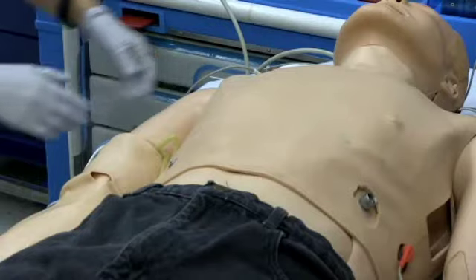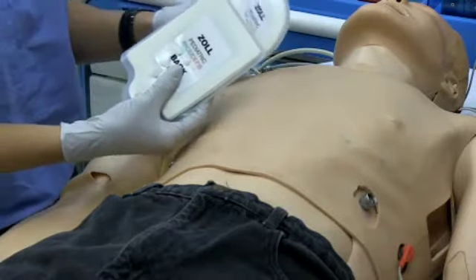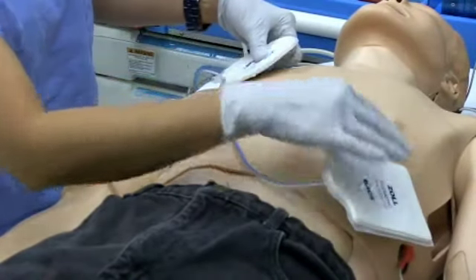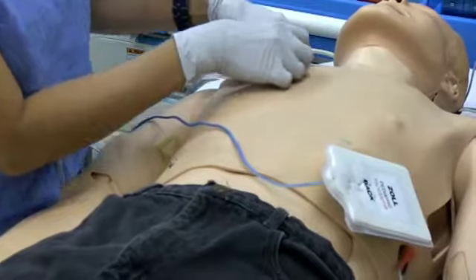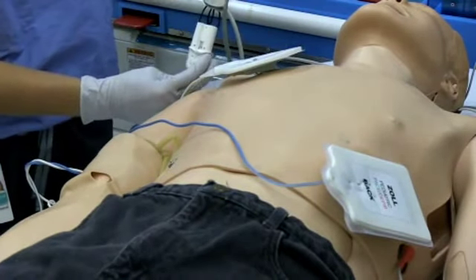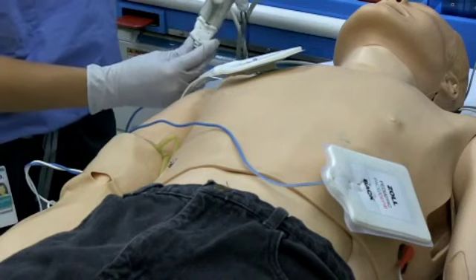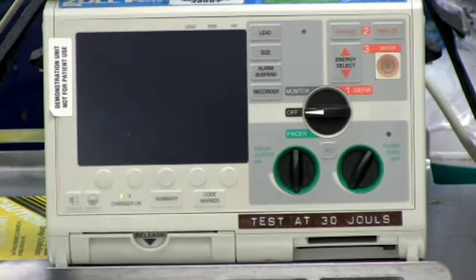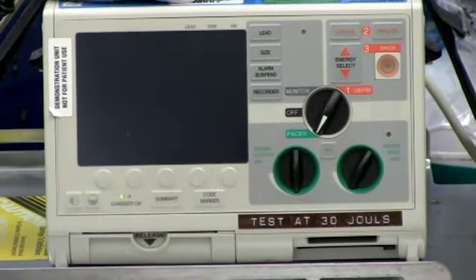Place the defibrillator pads on the right chest wall and lower left chest wall as indicated on the pads. Ensure that the pads are connected to the defibrillator. Turn the defibrillator dial to pacer, or press the on button if available.